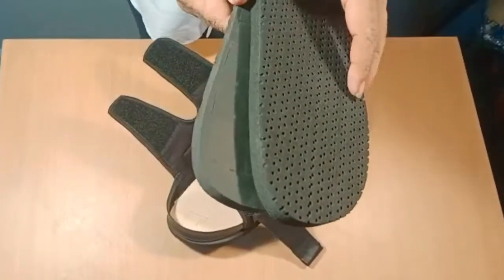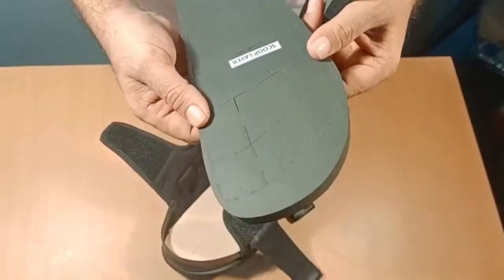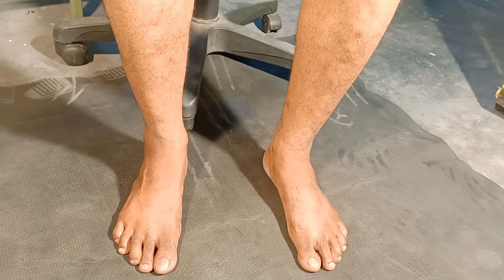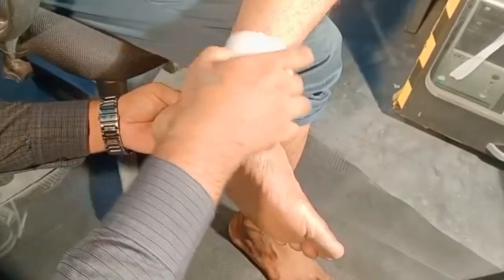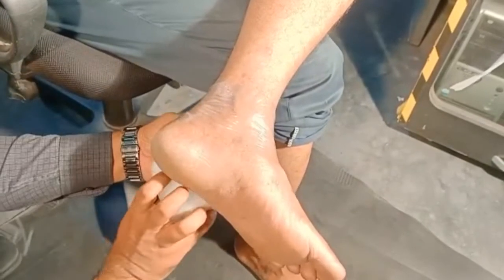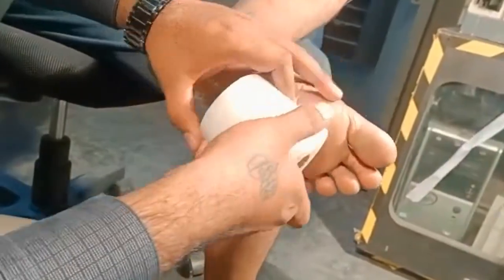This system has two insoles: a top layer with perforated top and a scooping layer with pre-cuts. This demo is for a patient with corns who requires offloading. It is always advisable to use gloves while taking measurements for patients with a foot ulcer.